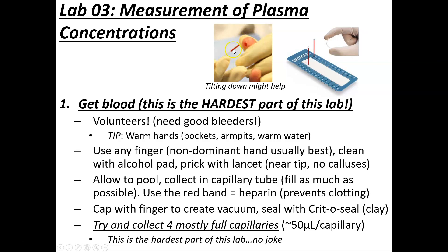Let the blood pool and then touch the end of the capillary tube to it. Make sure it's open on the other end — if it's not open, blood won't move up. It's called a capillary tube, or sometimes a micro capillary tube, because it works by capillary action; the cohesion tension of blood moves it up. We use heparinized capillary tubes. There are two types: plain ones with a blue band and heparinized ones with a red band. The heparinized ones prevent blood from clotting, so if it takes more than a couple seconds to collect the sample, it won't clot in the tube.